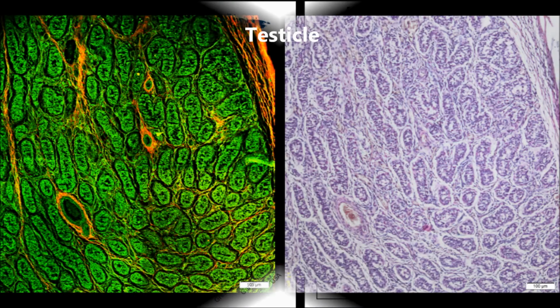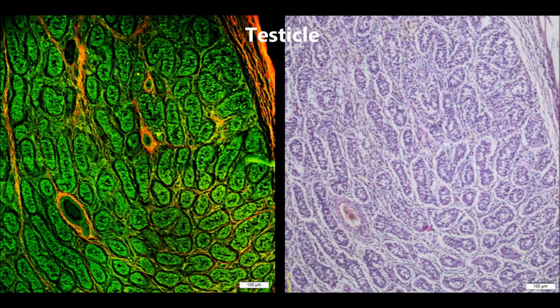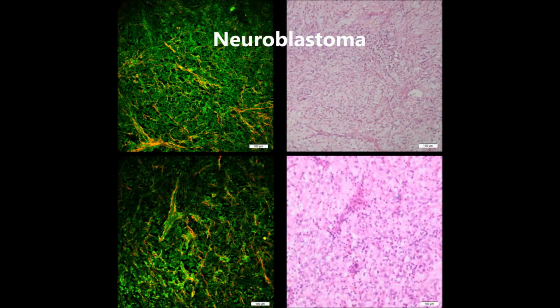Study results showed that currently and without prior training to the novel method, pediatric pathologists are more accurate in making a diagnosis on conventional H&E staining, but they are able to discern certain key features on MPM as well. While MPM lacked sensitivity for diagnosing the tumors, it seemed to be quite specific. Further studies are needed.